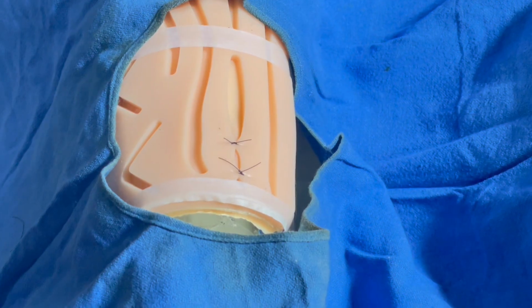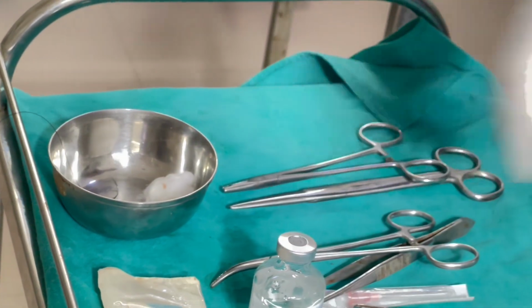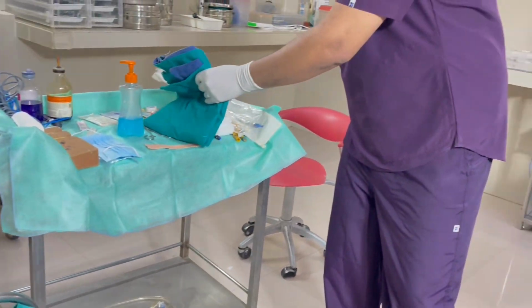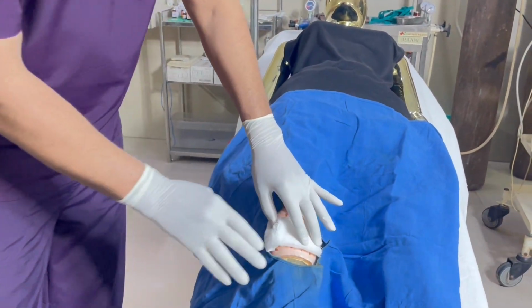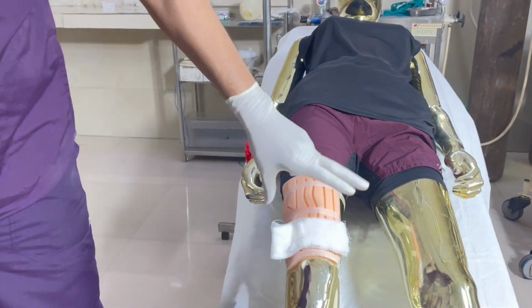So once I complete the suturing in this manner, so I will be disposing this sharp needle into the sharp, and then I will apply a sterile dressing and cover all these, and then dispose the drapes.